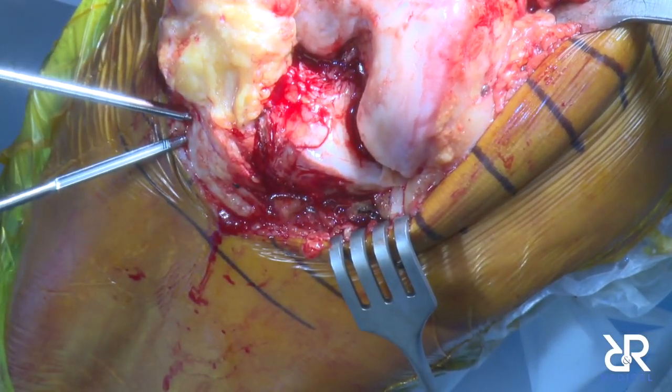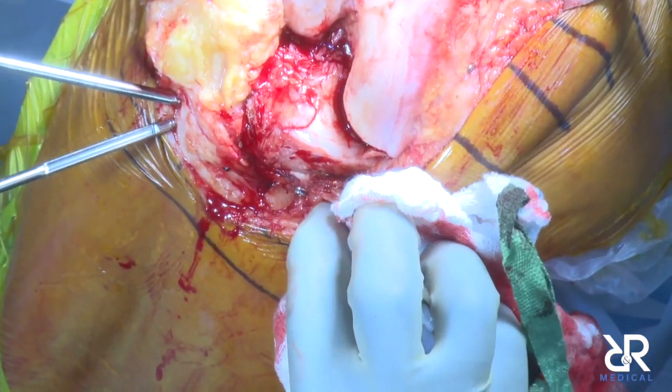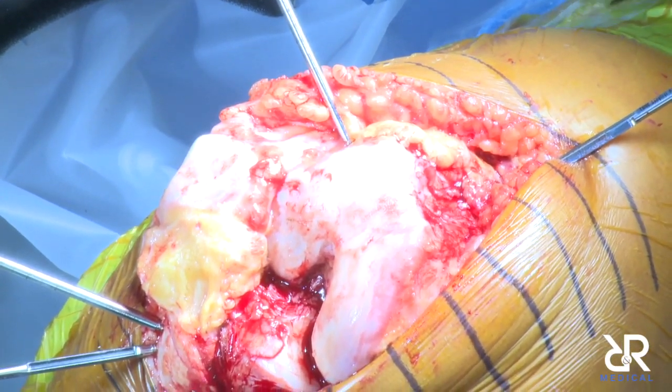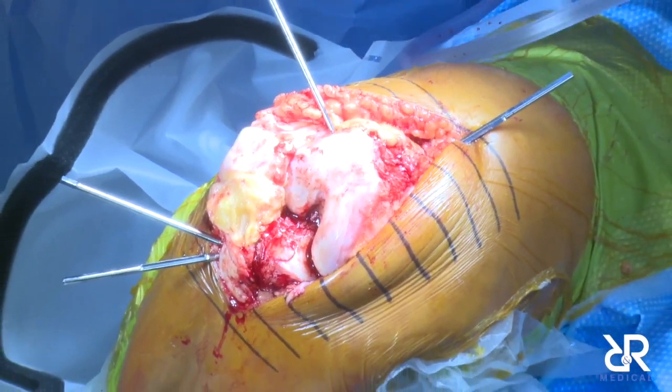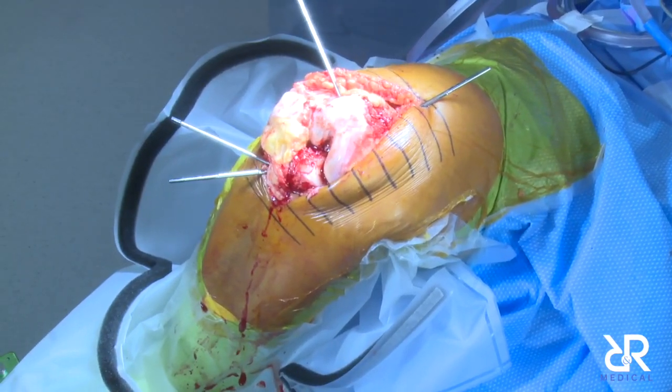So let's hope that that works. All right. Efficiency, you just got to try to do multiple steps, you learn as you go. And probably the most important part is that you have a good assistant so they can do the robot while you are doing the exposure and things like that.